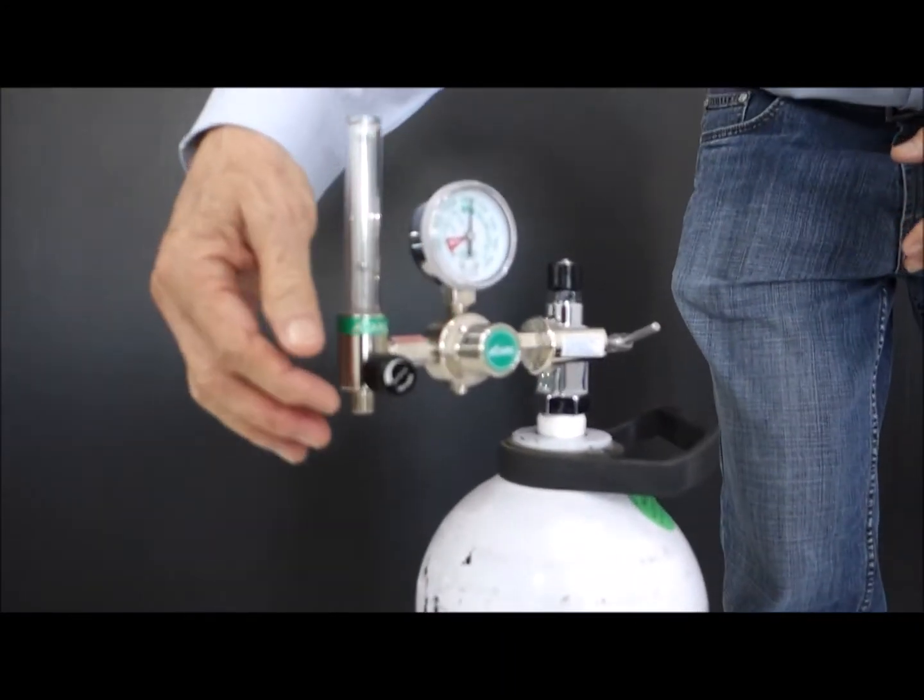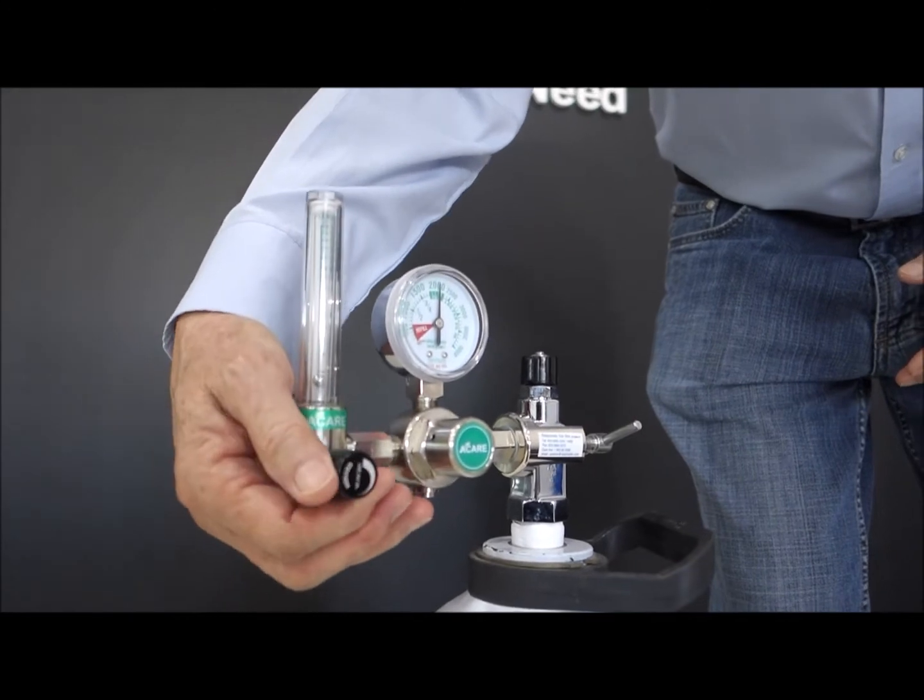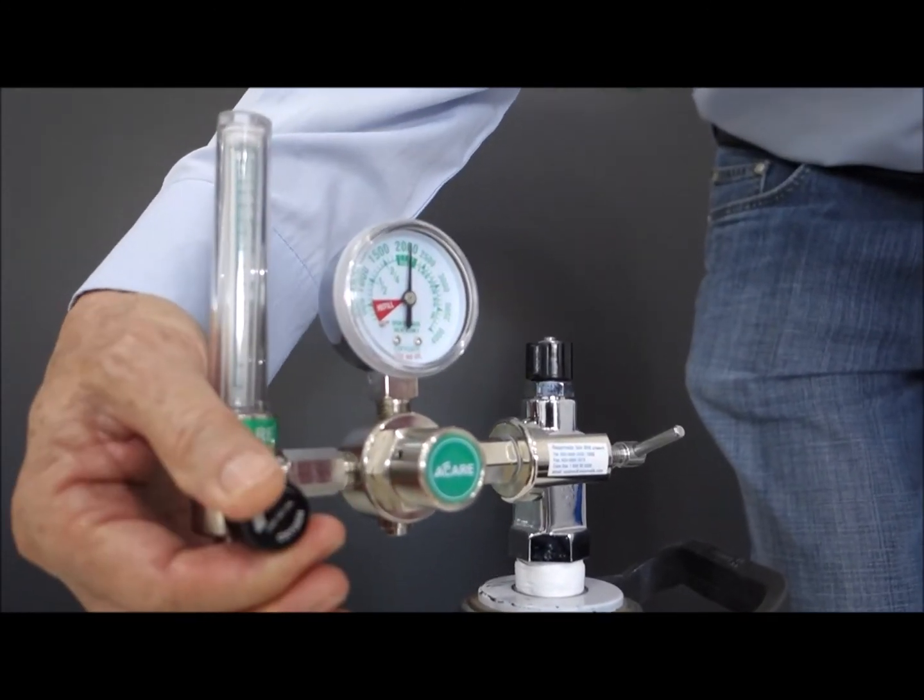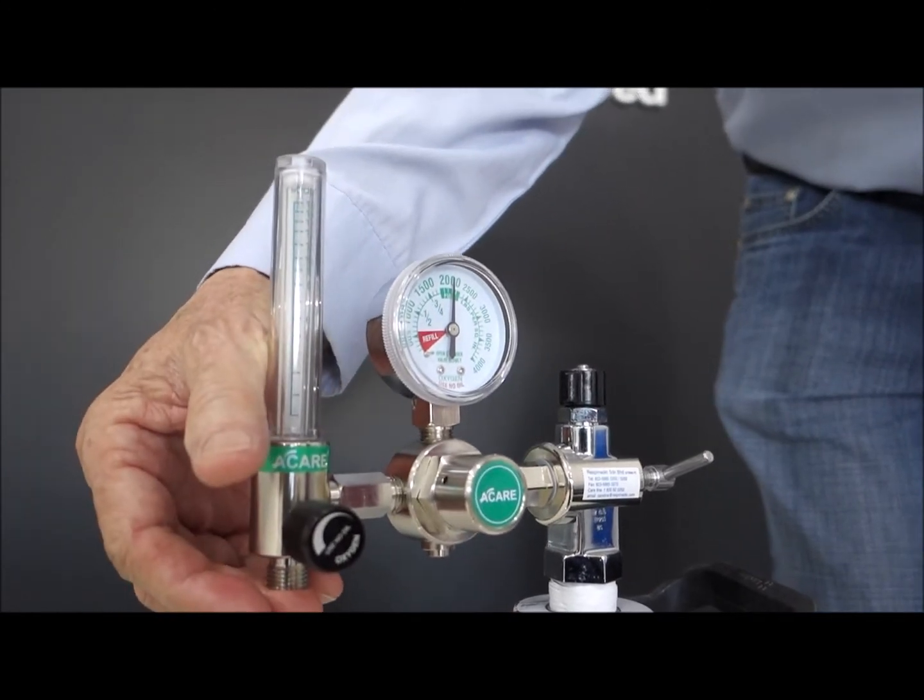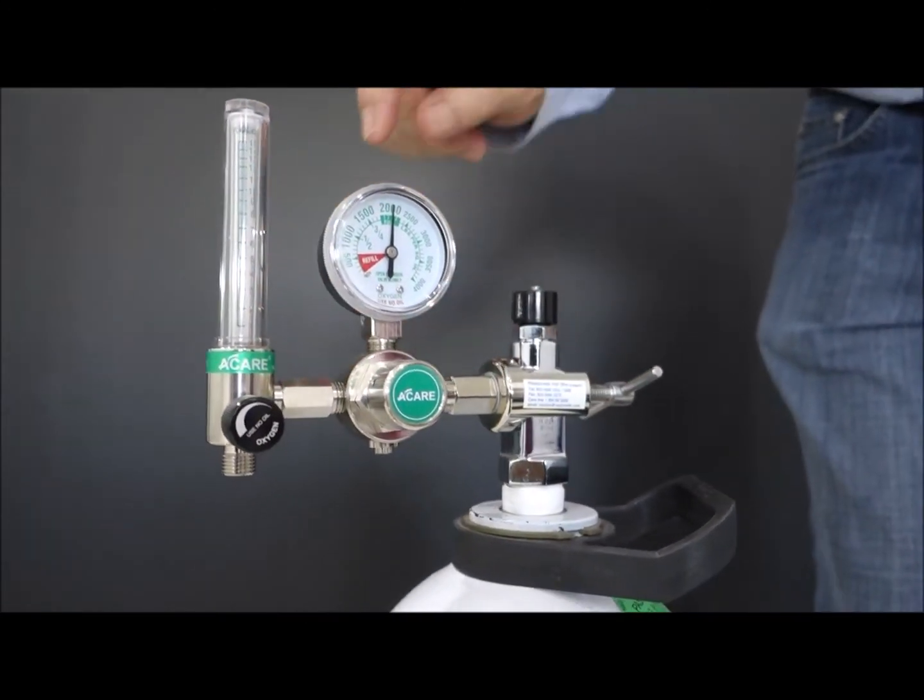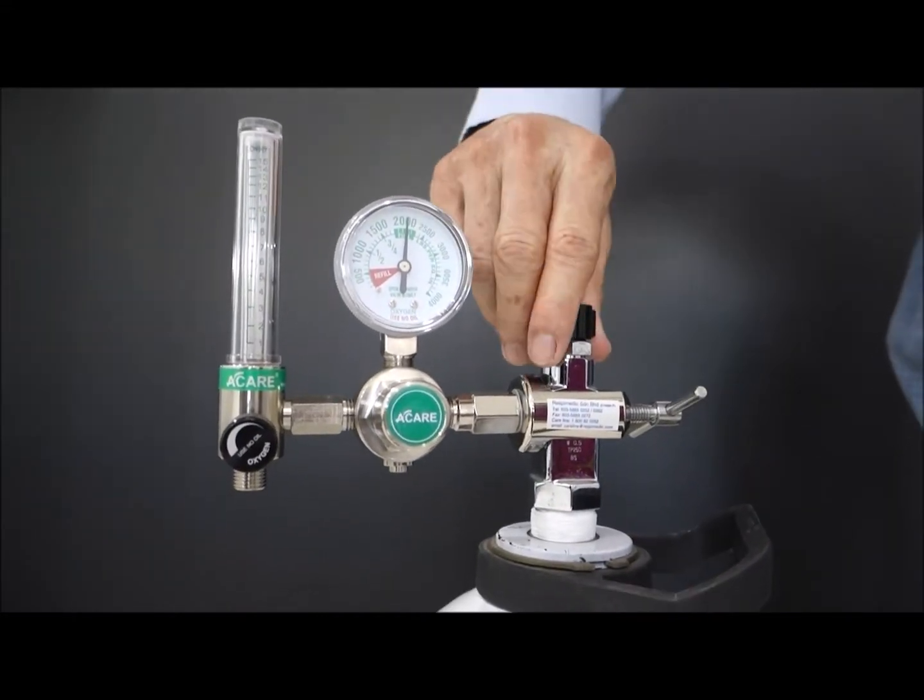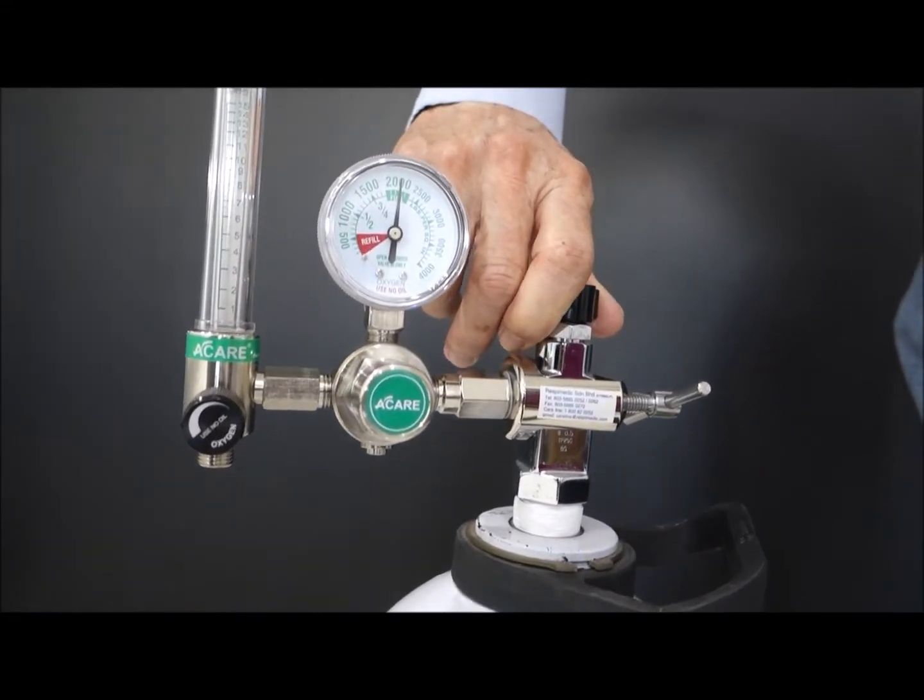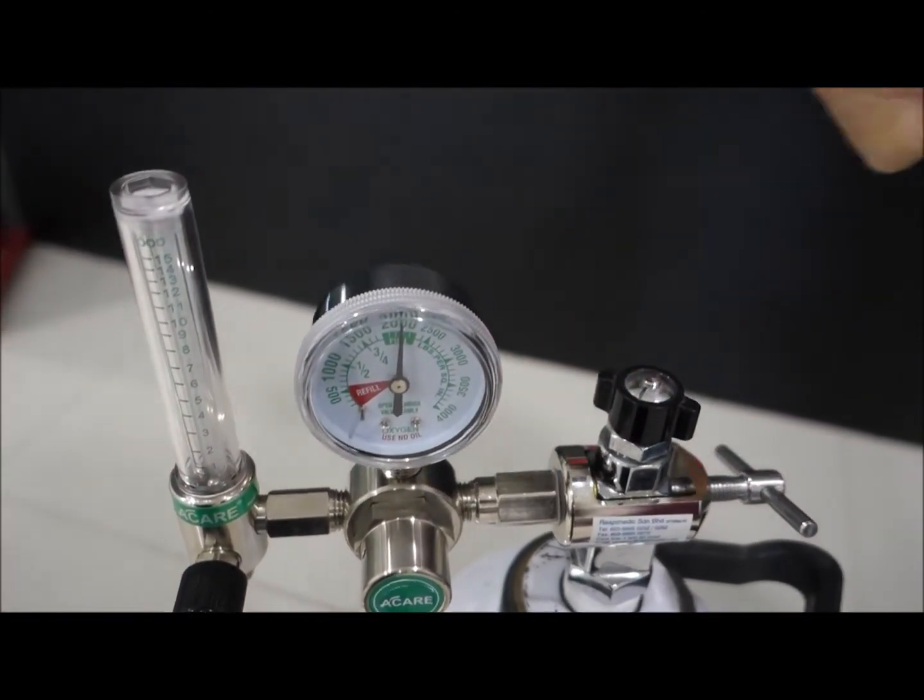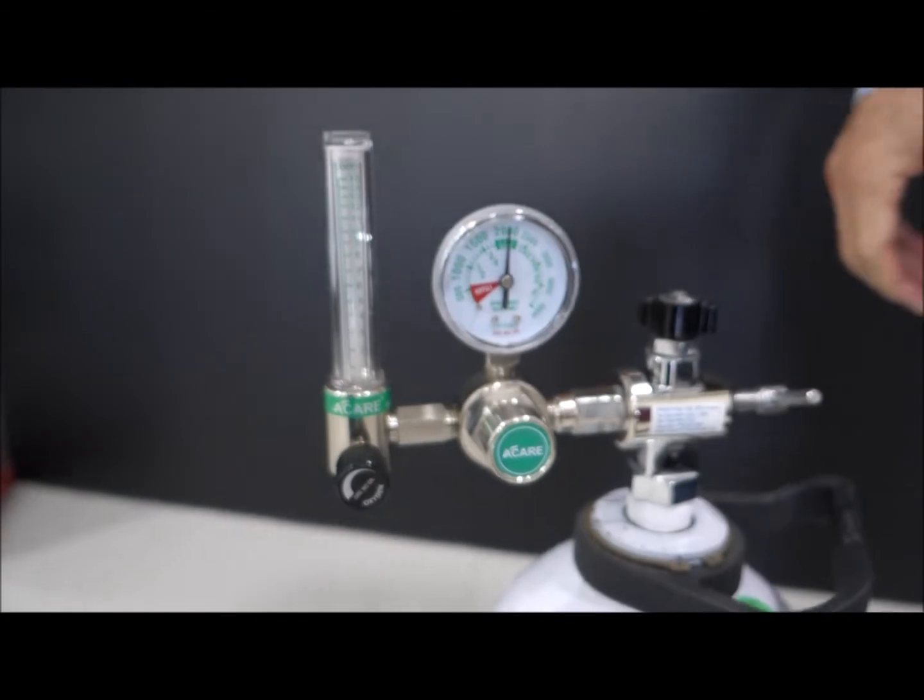And then of course, after you use it, then make sure, remember to turn off the flow, turn off the flow control, after you finish using it, to conserve the oxygen in the cylinder. But not only that, you'll see the pressure is still there. So remember, for safety, it's always best to turn off the cylinder valve also. Turn clockwise to turn off the cylinder valve.